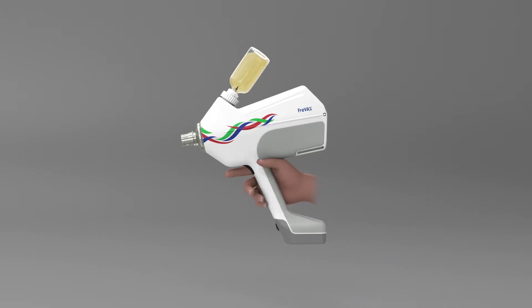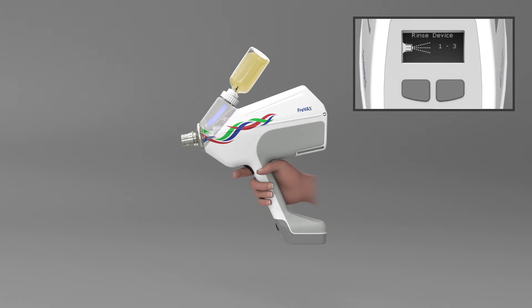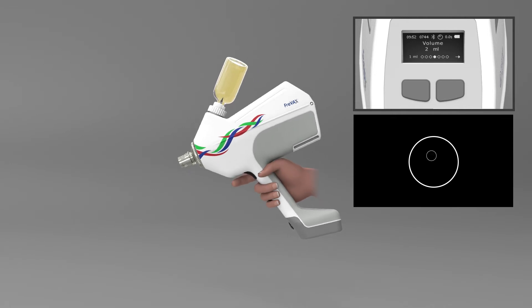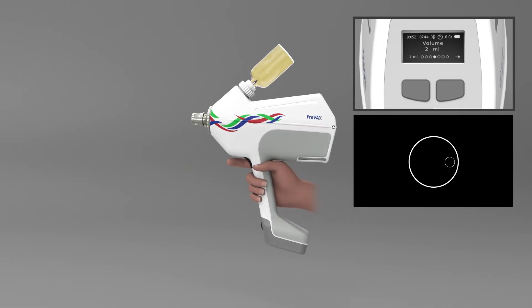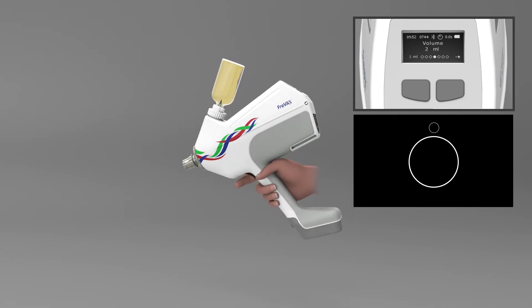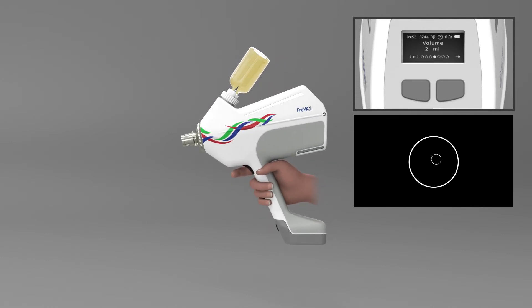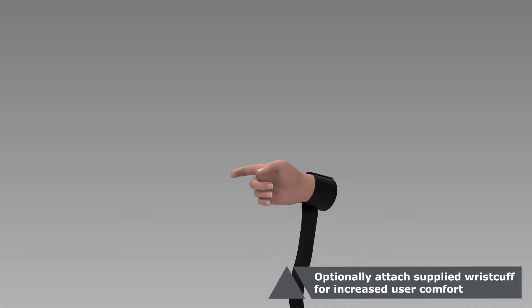After choosing your settings, push the trigger to prime the device with vaccine and rinse out remaining service fluid. This is done by three successive priming cycles, signaled by blue LEDs, during which the trigger must be held down. The device only allows liquid to be drawn in if it is held at the correct angle — if you move outside the tolerated angle range, the device will alert you. Optionally, attach the supplied wrist cuff for increased user comfort.